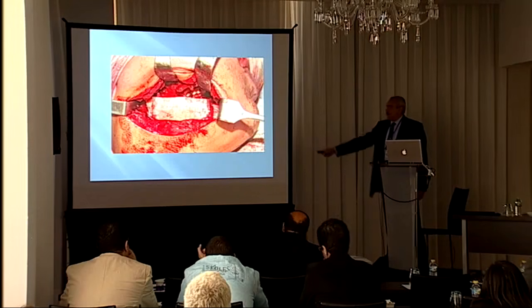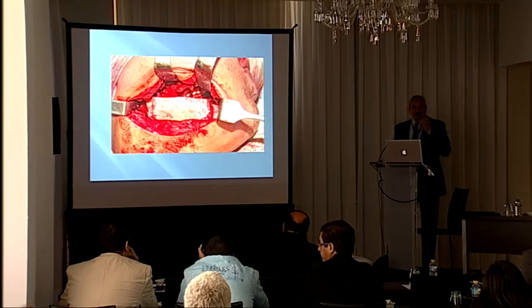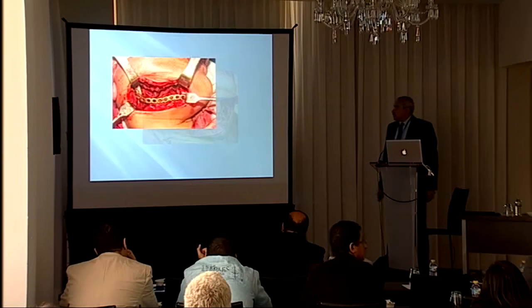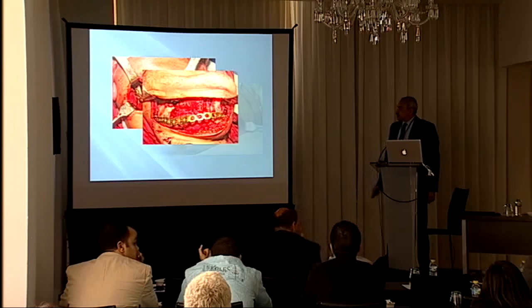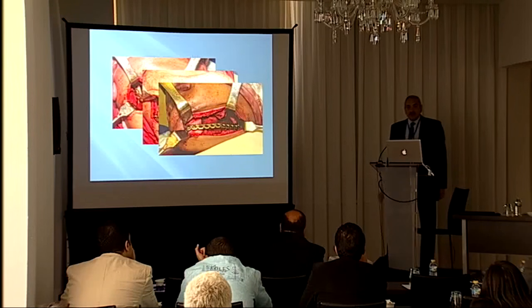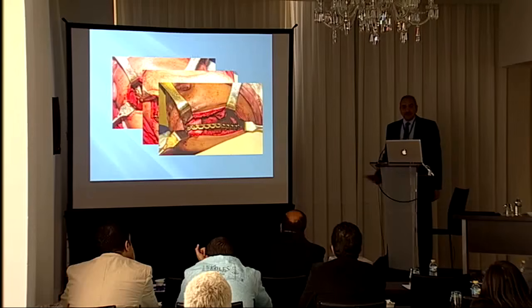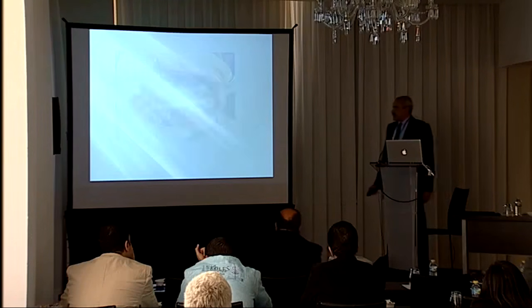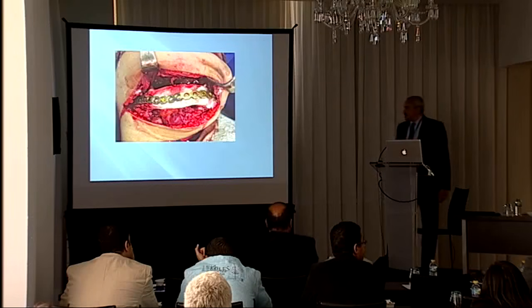This is the replica that we took from the other side, and it helps to position the segments together, and then we start placing the reconstruction plates, and I can assure you that all the reconstruction plates were fitted in place very well with almost no adjustment. The technique is extremely sensitive and accurate.